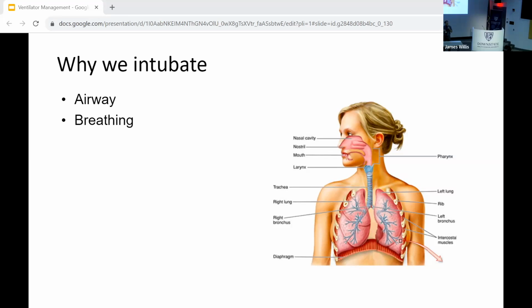But then ventilating the patient, this is the group of patients that are very difficult to ventilate. These are the group of patients, the ARDS, hypoxic respiratory failure, that we're potentially sending to LSU for a VV ECMO consult. And so then all the stuff that goes along with that, if they require a lot of that vent management and it's challenging, maybe also some higher sedation requirements. This is going to be the focus of our talk.